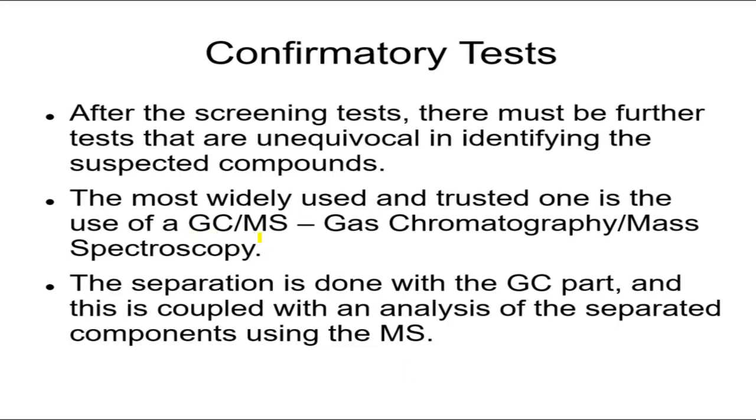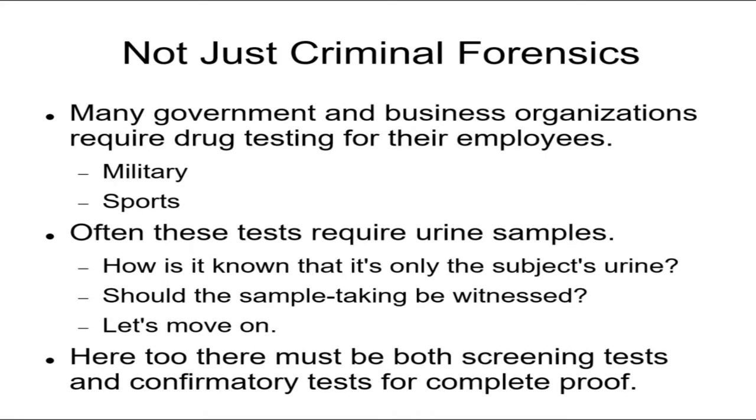Incidentally, the gas chromatography mass spectroscopy works with even tiny, really minuscule amounts, even in the nanogram scale. These things are really, really good. They've been developed so that they are very good at identifying really tiny trace amounts of compounds that we want.